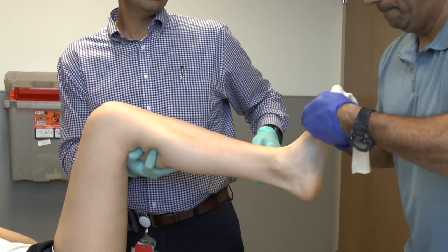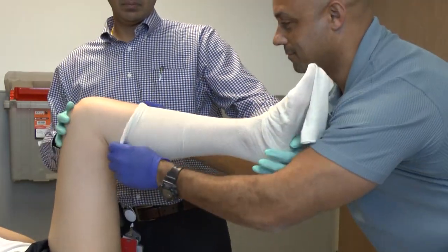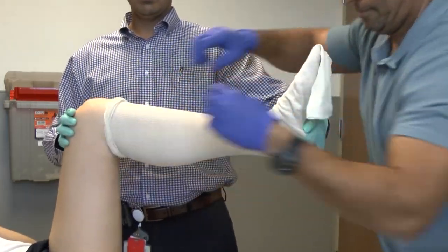Placement of a short leg cast does require the utilization of a second partner, so the leg can be held in a good position while the cast is being applied.